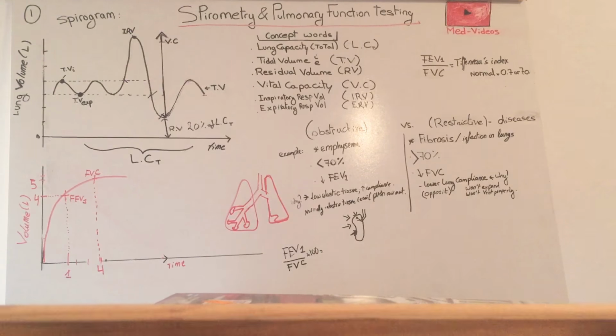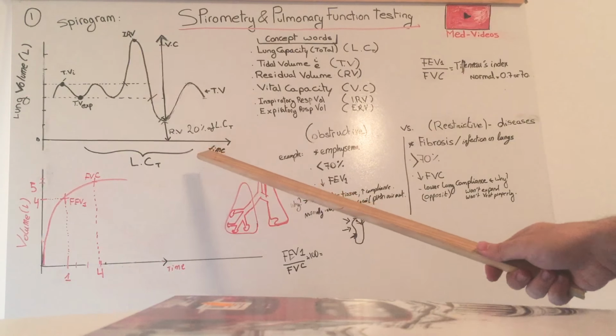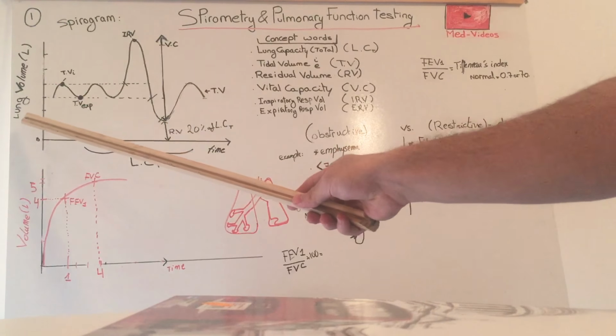Good morning, everyone. Today we'll teach you how to become better physicians by understanding spirometry and pulmonary function testing. The first thing you want to notice is the first graph, which is your spirogram. On the x-axis, you'll notice time, and on the y-axis, you'll notice the lung volume.